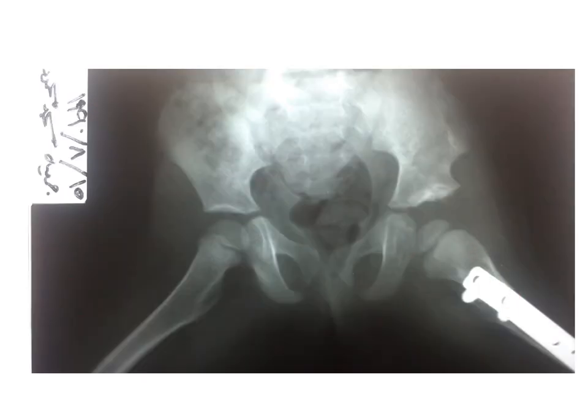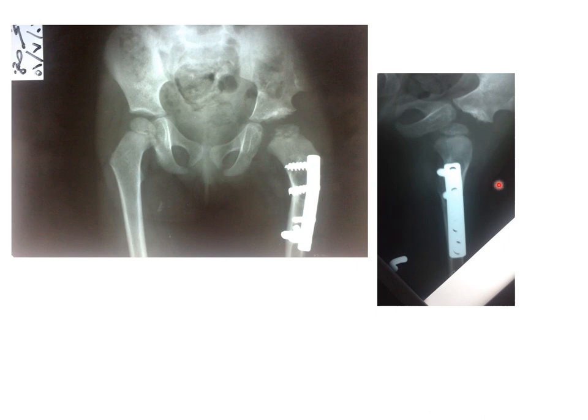This is the lateral view. Putting the two views together shows the coxa vara and the anterior angulation on the lateral view. These are the documents regarding her operation: open reduction, Salter operation, and sub-trochanteric osteotomy, performed on the 5th of March 1989.